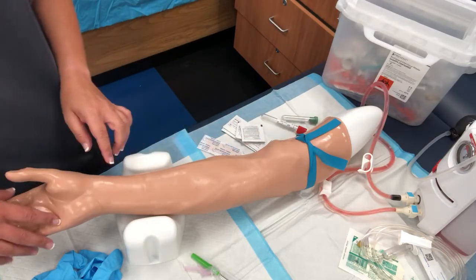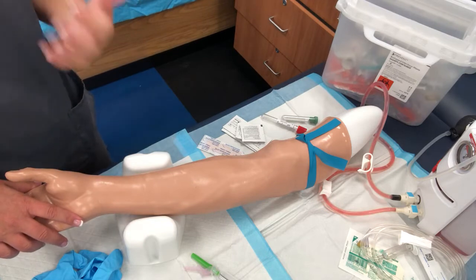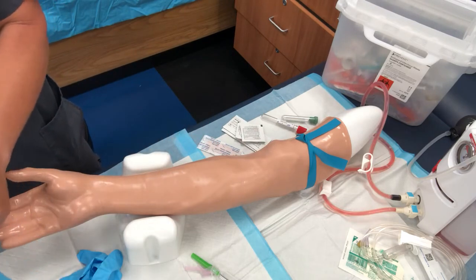Now, I would ask my patient to simply make a fist. Again, we are out of the habit of asking the patient to squeeze their hand. Lowering this to gravity, it's going to help engorge the veins as well. And at this point, you can go ahead and put on your gloves.